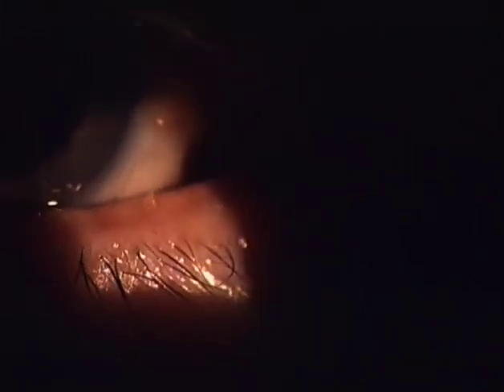Another occluding factor may be the secretions themselves, which are easily visible if protruding, as here, where they have formed a peak when drying. In this case, however, the occluding secretions form flat scales on the surface, and thus are difficult to recognize. Only by lateral indirect illumination can their margins be made out clearly.